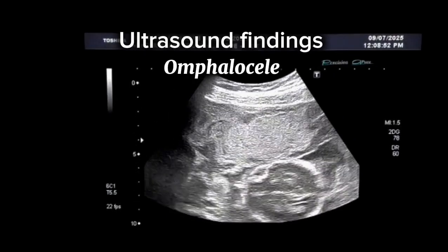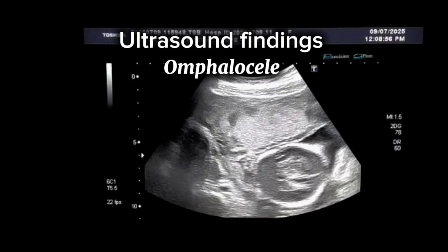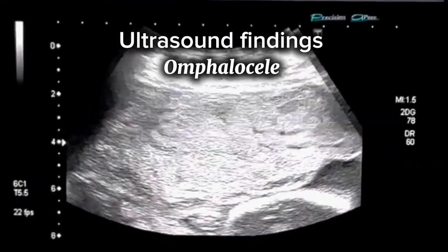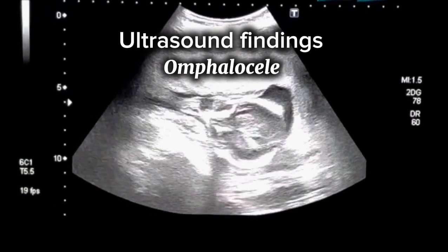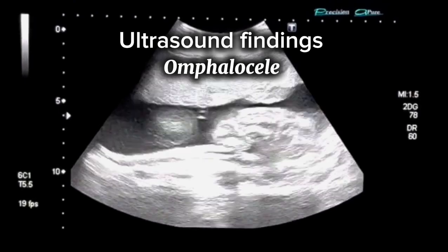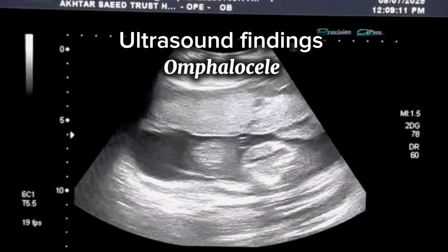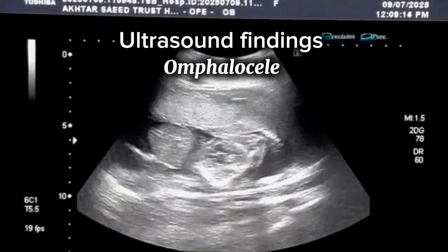A 29-year-old woman currently in her second trimester presented for a routine mid-trimester anomaly scan. Her pregnancy so far has been uneventful with no history of fever, bleeding, trauma, or infections. The dating scan ultrasound was reportedly normal. There is no known family history of congenital anomalies and genetic screening was not performed earlier.